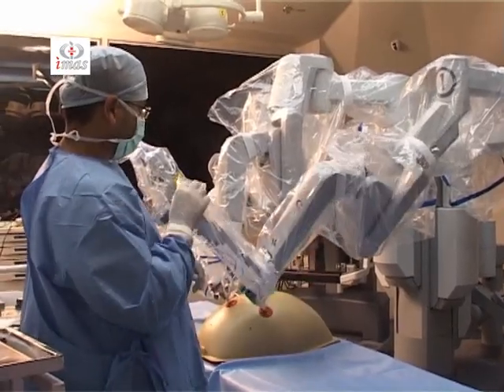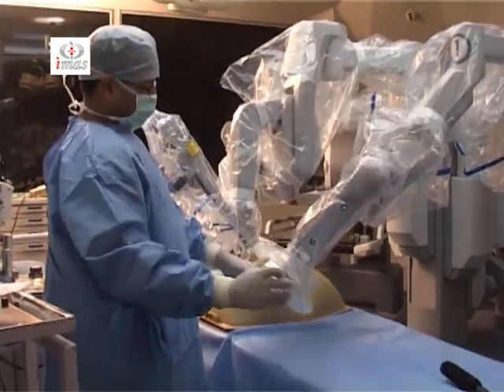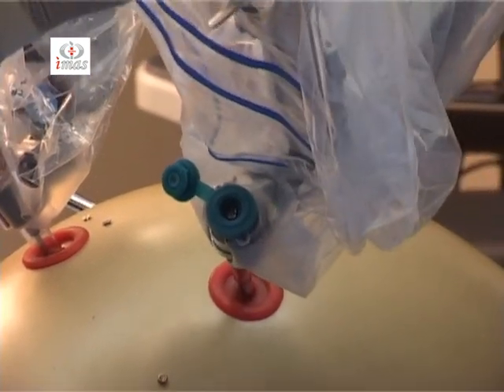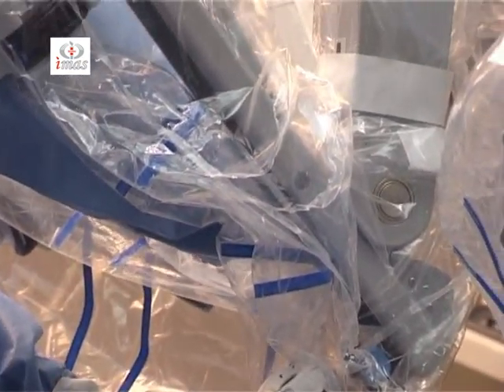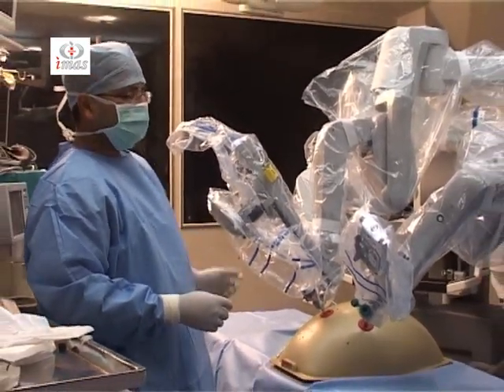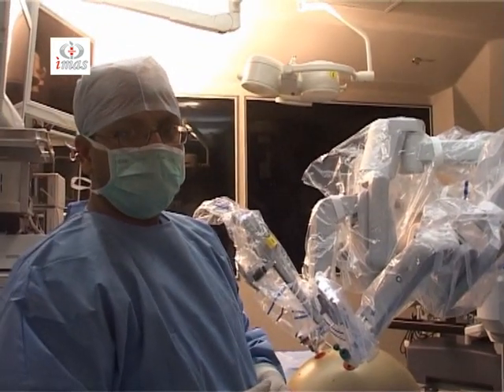So these setup joints can move without causing any external arm clashing, and this is not causing any trauma onto the abdominal wall because the remote center is at the fascial level, so that point is not at all moving while you are moving the robotic arm. The remote center has always to be taken at the fascial level. You can see here also it is moving nicely. Now the scope will be put inside and you can start operating using the master console.